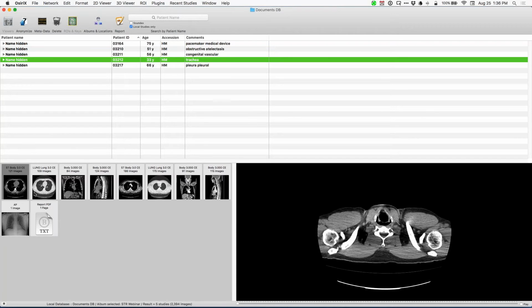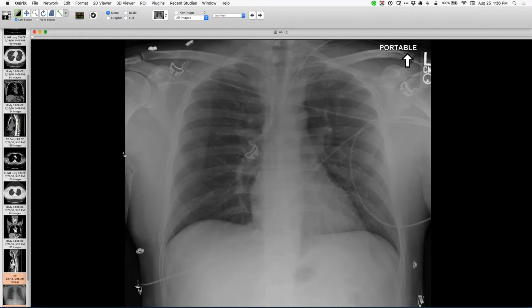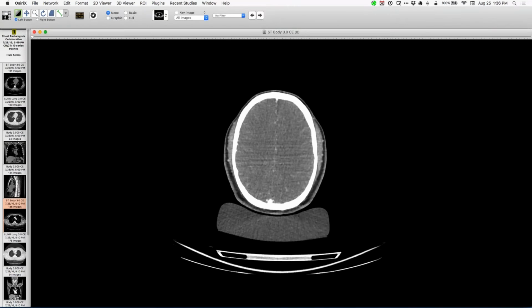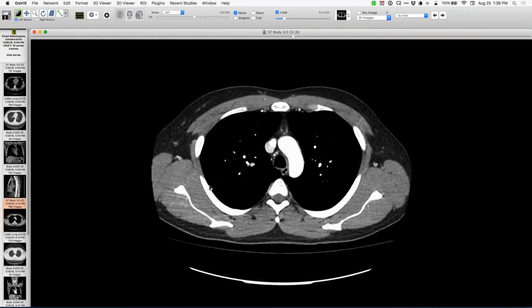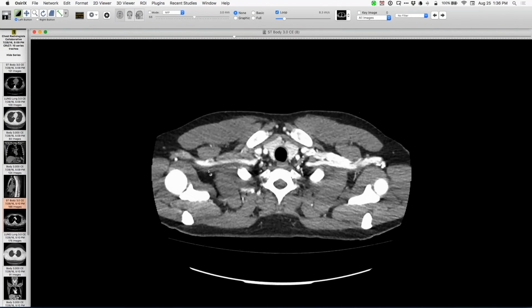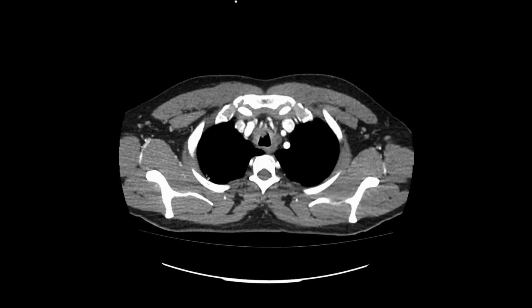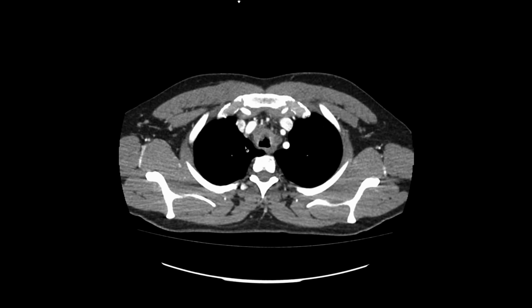This is the kind of case we've all seen before. So the radiograph is really just a bedside radiograph. It's going to be very hard to see this. So let me just show you the tracheal lesion. And it's rather large and rather disturbing. So here's a relatively young person with this very nasty looking tracheal lesion. It narrows the lumen. It's near circumferential, but it's pretty bulky. Anteriorly, it encroaches on the lumen right there.